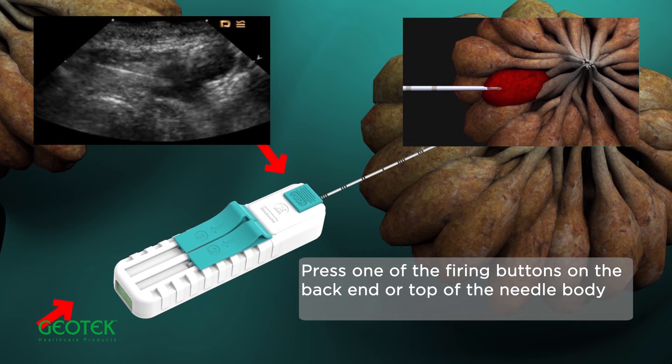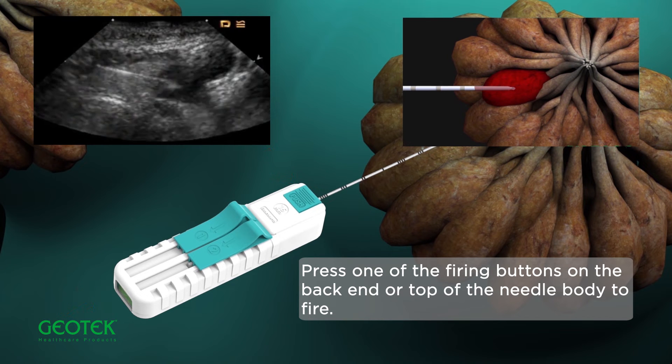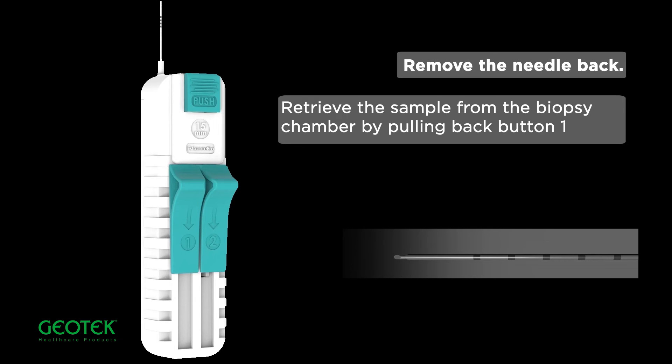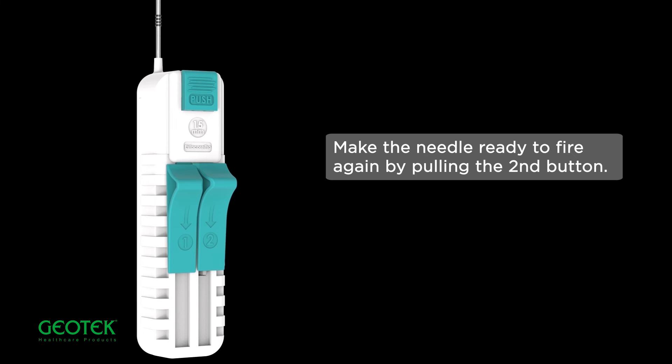Press one of the firing buttons on the back end or top of the needle body to fire. Remove the needle back and retrieve the sample from the biopsy chamber by pulling back button one. Make the needle ready to fire again by pulling the second button.